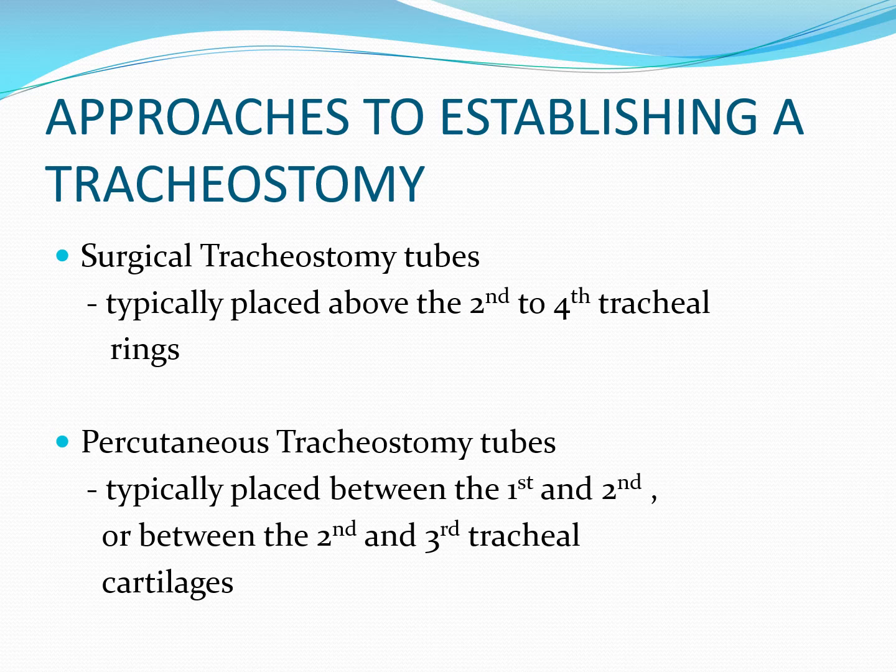Many of these patients have an endotracheal tube in place already, so there's great coordination between the physician doing the procedure and the respiratory therapist as far as managing the patient on the ventilator, but also in very gradually, on the request of the physician doing the procedure, removing the endotracheal tube. And only remove it once end tidal has been confirmed through the tracheostomy tube.